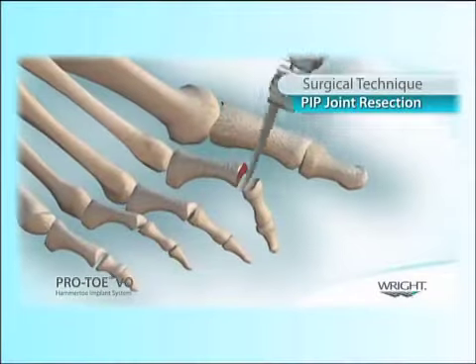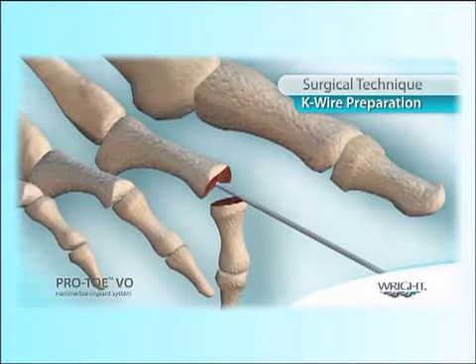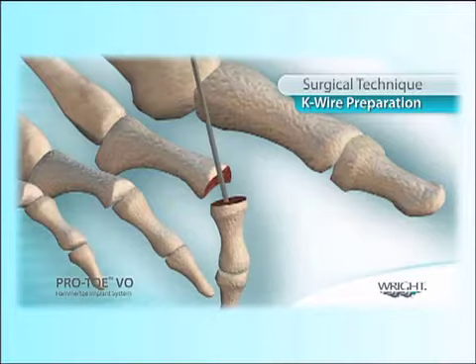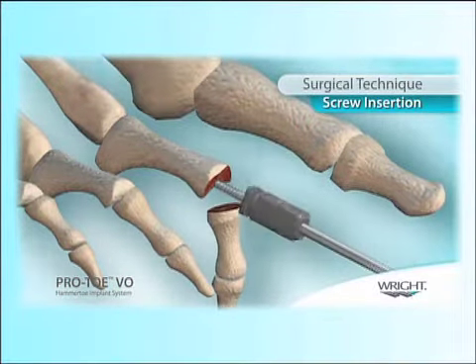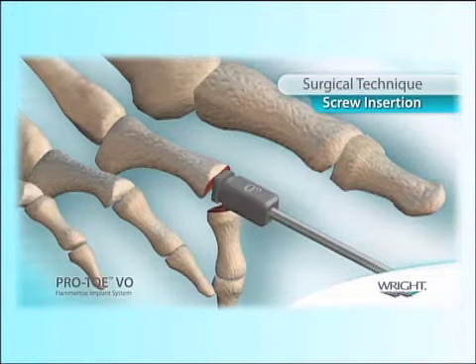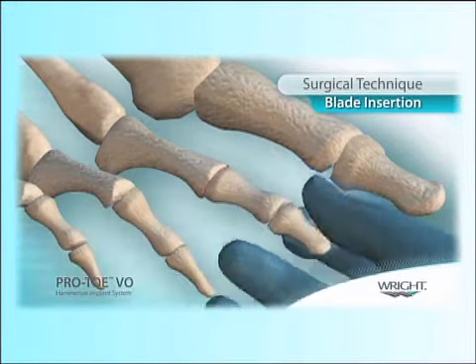If you'd like to see an animation, you'll see that the procedure basically is shown. Okay. You can see that the procedure shows what we do is first remove the bone. Once we remove that knuckle, we actually drill a hole inside the bones to place this new internal implant. Now this implant sits inside the bones, connecting the two toes together. And we drill it carefully.